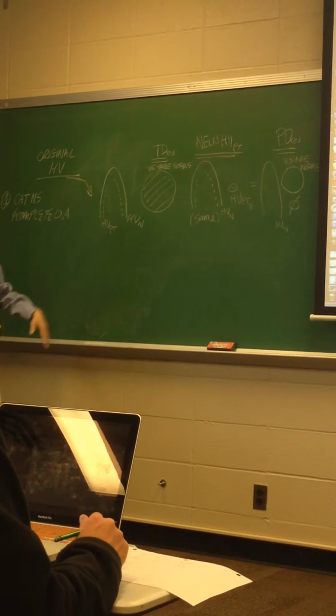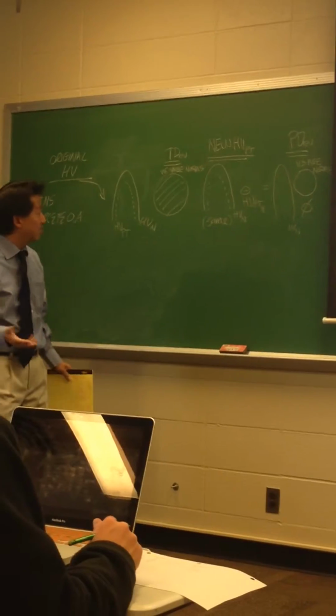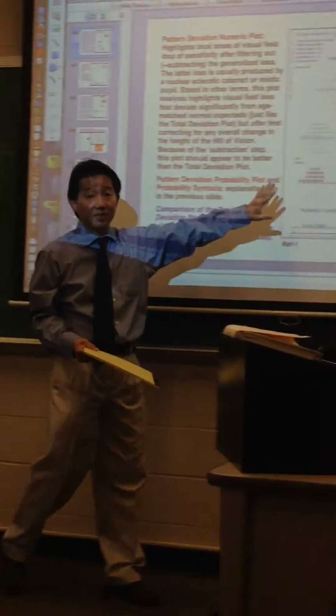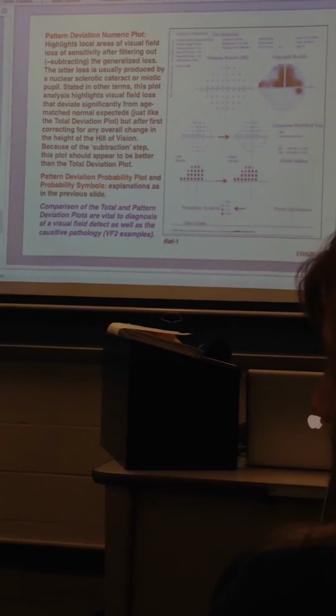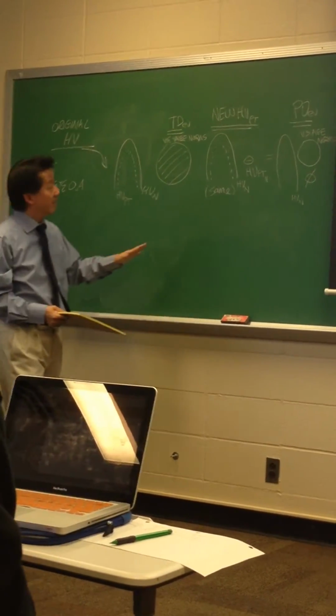Is that saying that it's blacked out, those lines, or you're saying there's an area? Yeah, it's just relative. If it's clear, it's white. If it's dark, you have loss. Okay. But this one's saying that it's loss even across the entire field? Yeah, because it's a full cataract. Okay. All right.